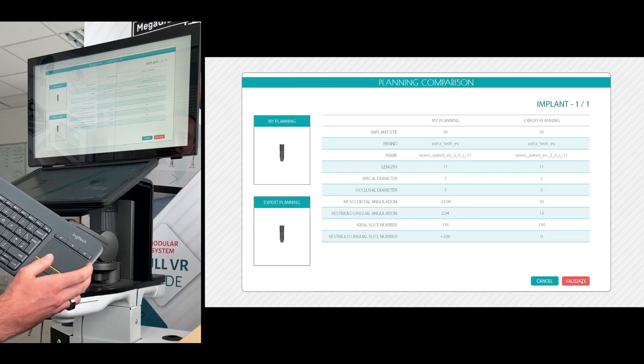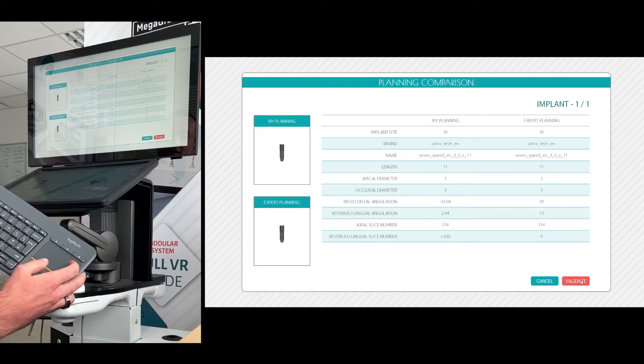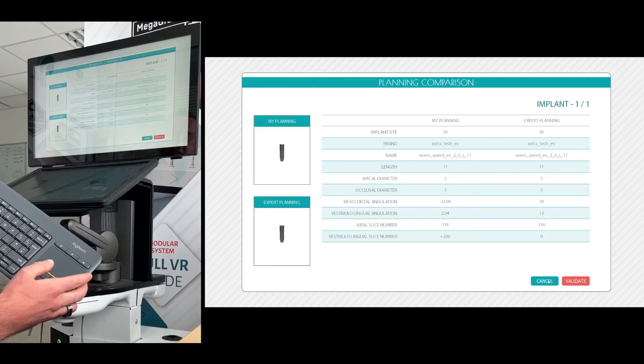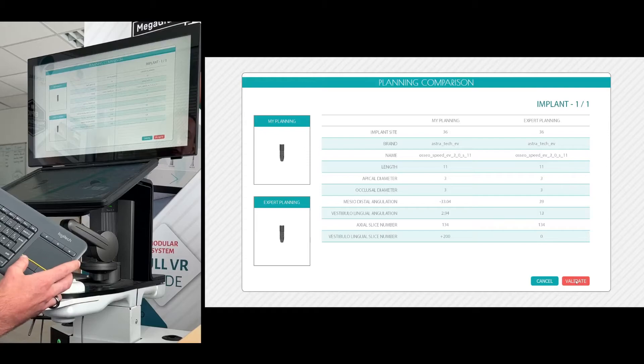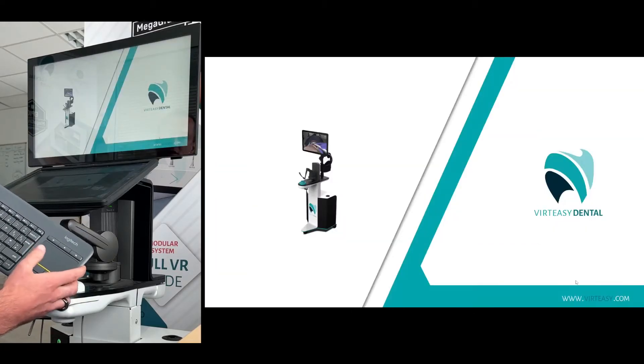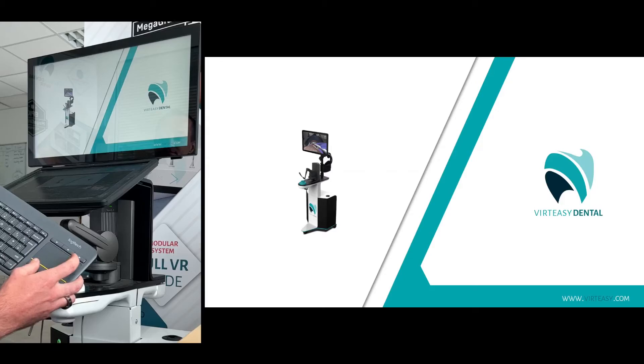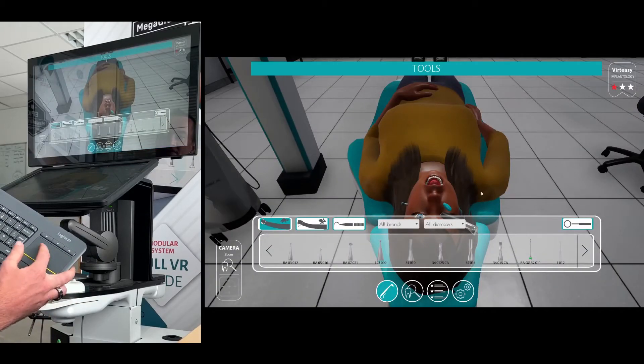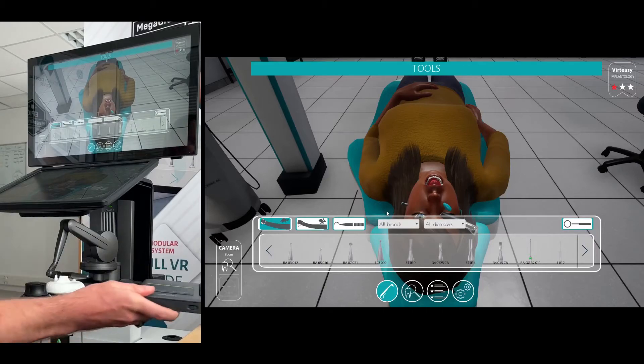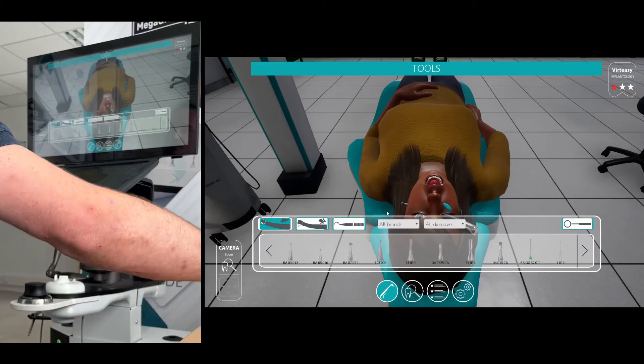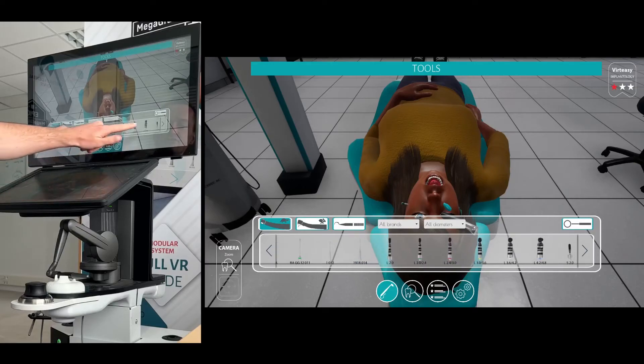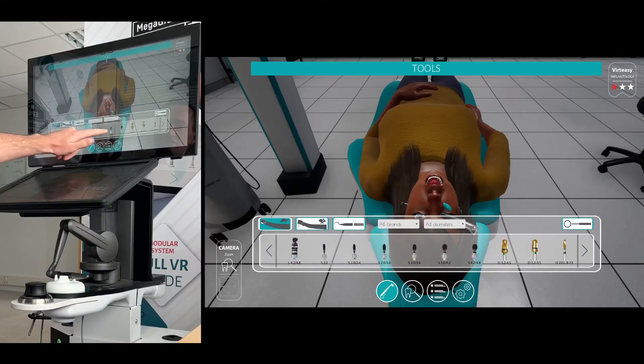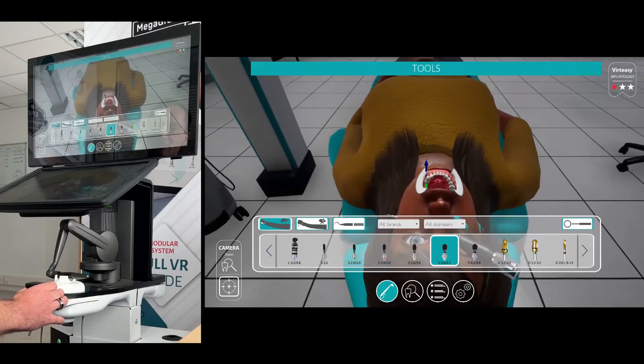So I go ahead and click validate at the bottom right if I want to use my planning or cancel just next to it if I want to go back and load the expert plan. But I'm going to go in and click validate and then this is going to load up the simulation. So now I can pose the keyboard down. I have all my various tools for implantology just as we go along here. I'm going to choose one and the patient's retractors go in.